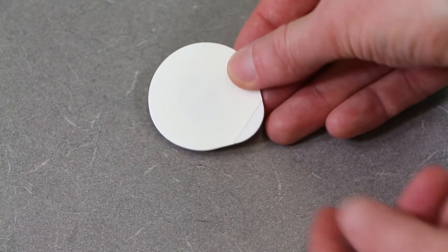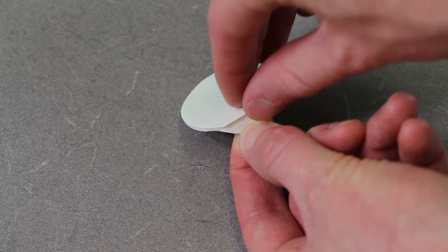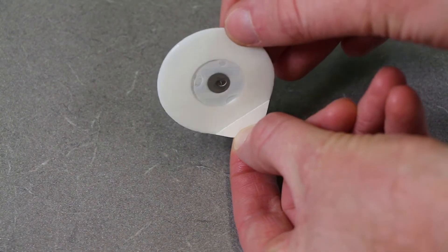Go to each spot roughing it up, and then clean each spot with an alcohol swab. This serves two purposes: one, to remove the dead skin cells you just scratched off that are still on the tissue, and two, to remove any oil on the skin. The whole purpose of this prep — the roughing and the alcohol — is to increase conductivity of the skin, because we're looking at the electrical activity of the heart and conductivity is very important. Once you've finished roughing the skin and cleaning with alcohol, let the alcohol dry and then apply the sticker electrodes.